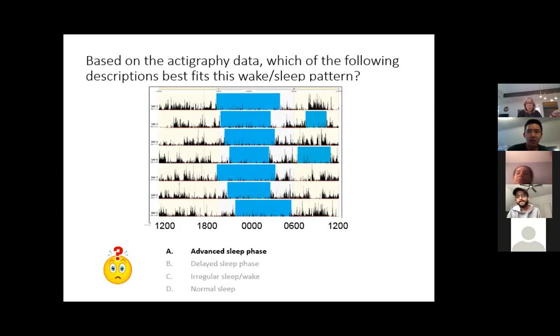This is going to show up on your boards, guys. Be prepared. Is everybody comfortable with that now that you sort of see it? I think it's the bedtime part that kind of threw me off. Wake time definitely advanced. But what time do old people get up? They get up at 4 in the morning, right?